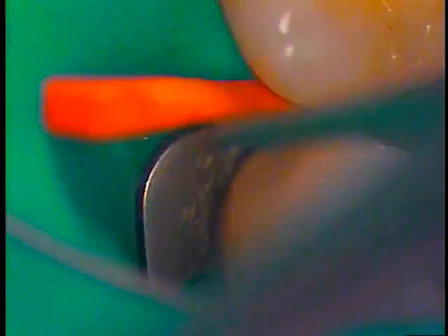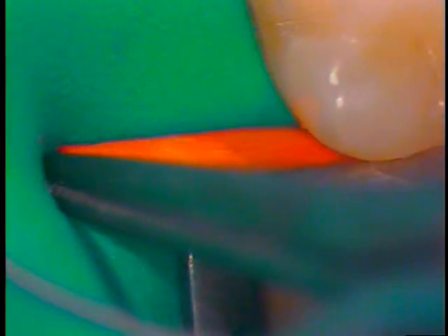I'll use at times either plastic or I like wedges. I'll pre-soak the wedge. This is an anatomical wedge. I'll try to slide that one in first, make sure we get a good separation, and make sure the rubber dam clamp might have a little something to do with this one.